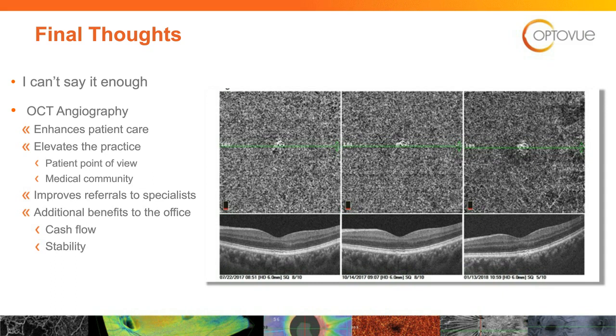Now the OCT regarding drusen, you could see how the drusen create compromise to the vasculature of the radial peripapillary capillaries, and then you can see how the nerve fiber layer is compromised. So that's question number one. Let me filter through here for another question.